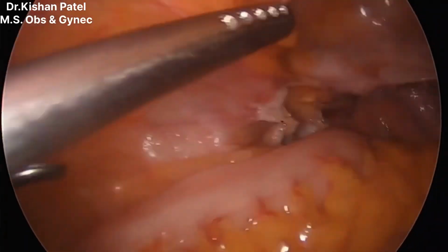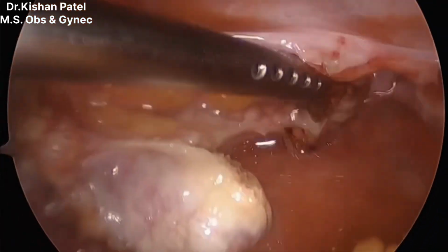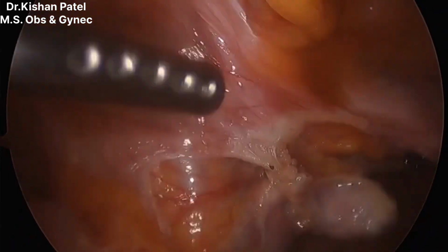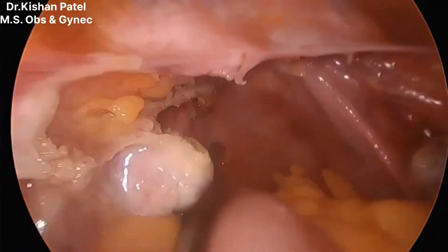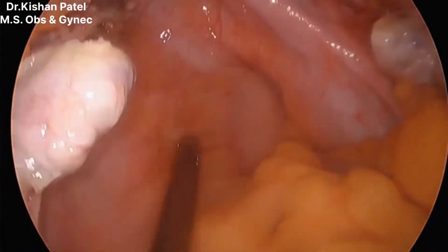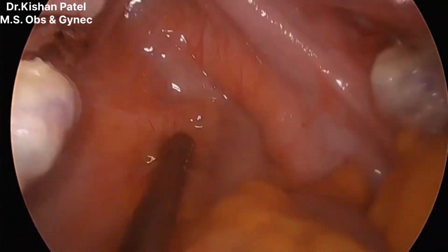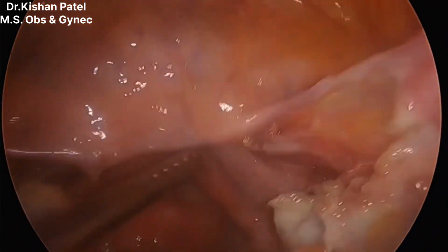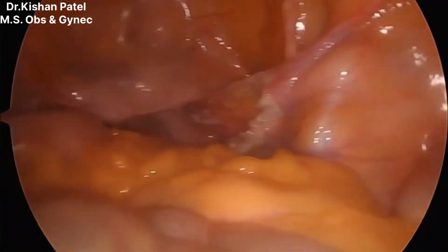Uterus is removed and suturing is completed. We are giving a saline wash and will suction. We will inspect the adnexal structures, uterine vessels, uterosacral ligaments, and the vault itself. Of course, there is no bleeding. We will suction out the remaining NS from the cavity.